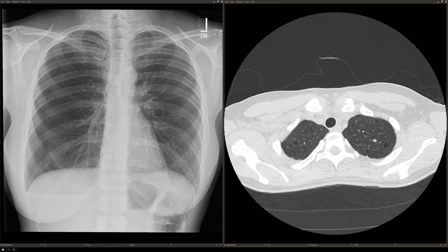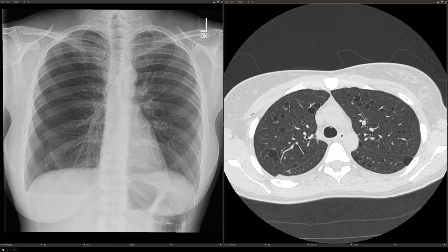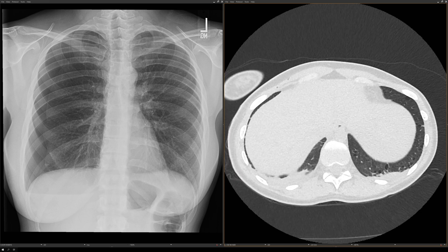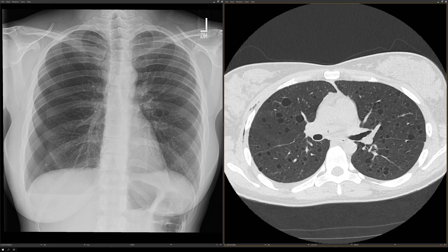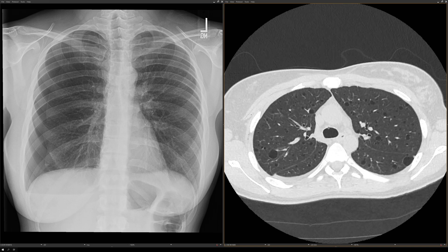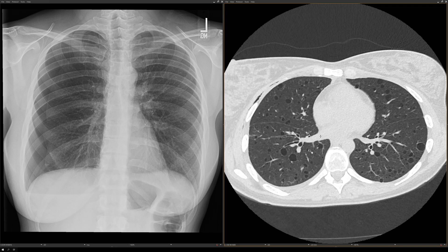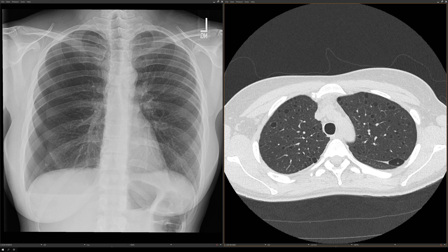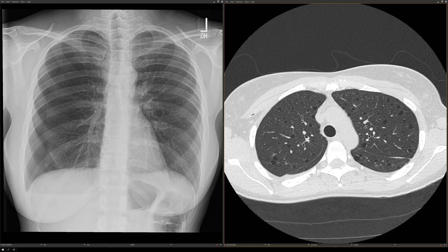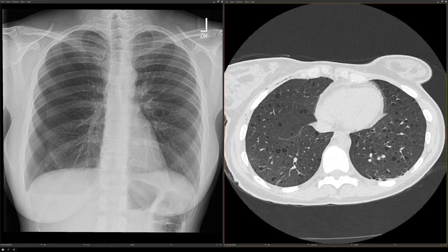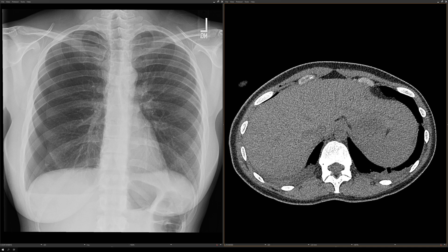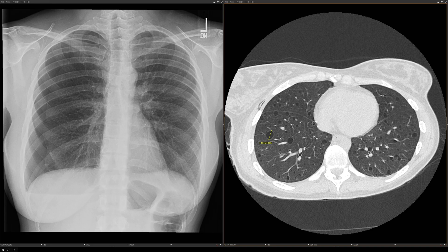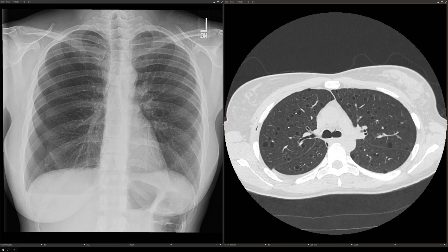The chest CT was done a few days later. On CT, you can see numerous cysts throughout both lungs. Scrolling from apex to bases, there's no real apical to basilar gradient — the number of cysts is about the same in the upper and lower lungs. The subcutaneous emphysema is because she had a chest tube placed. There's a small loculated pneumothorax in the left major fissure, plus small bilateral pleural effusions. Most cysts are fairly small, with the larger ones up to about 1.5 centimeters. This is a classic appearance of LAM.